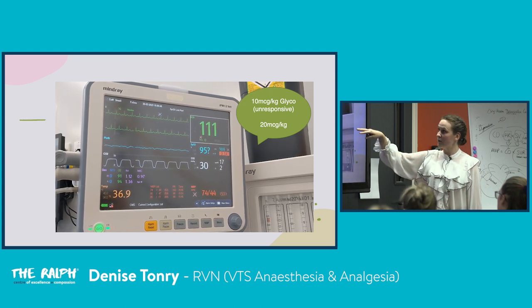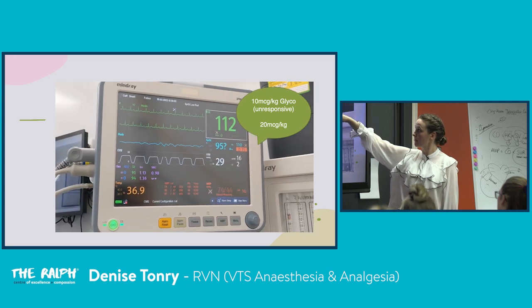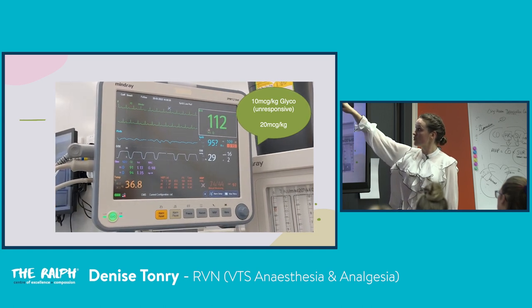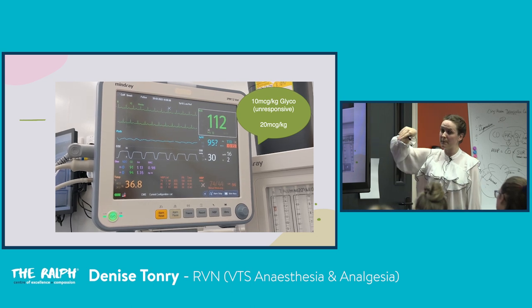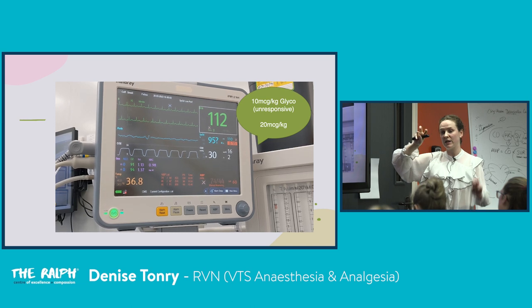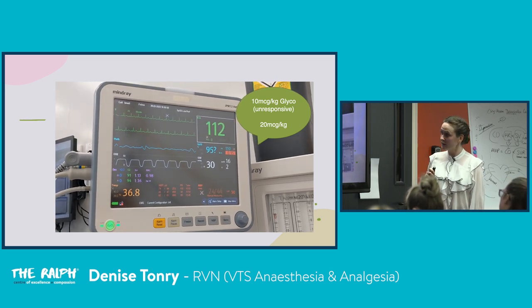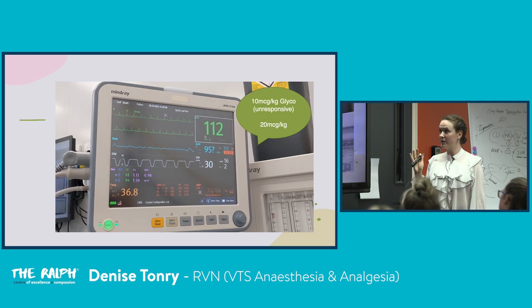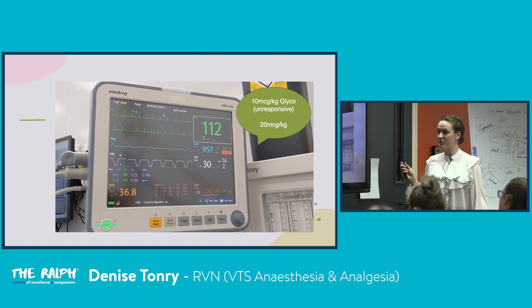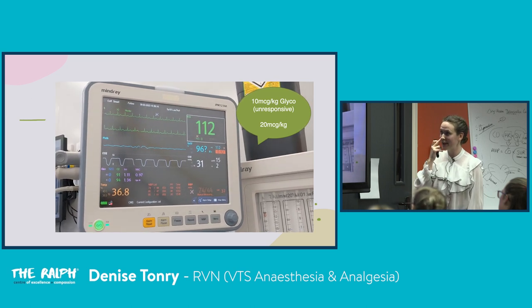And you can see that this heart rate was 96, and I've given the atropine, and it's increasing at 20 microgram per kilo. So usually our CPR concentration of atropine is 40 microgram per kilo. So I'm giving half of what we use in CPR. So generally atropine does the trick. And this cat, of course, increased the heart rate by 10 and the blood pressure not at all. So I kept running back outside and saying, no, again.